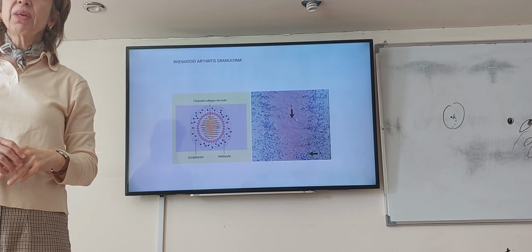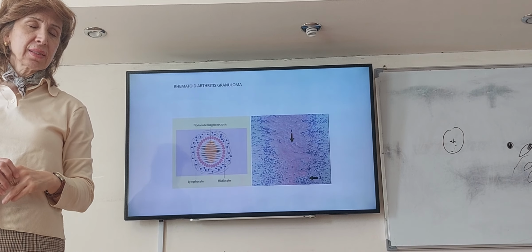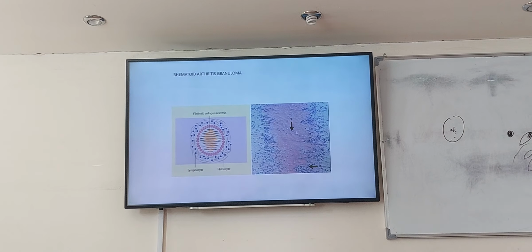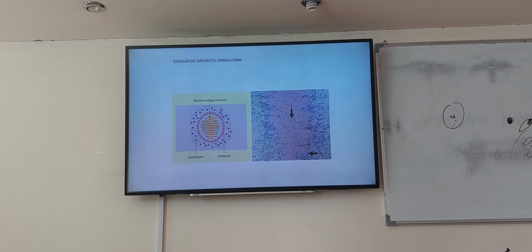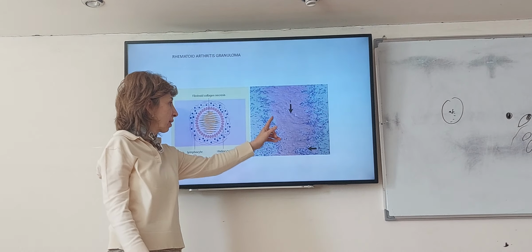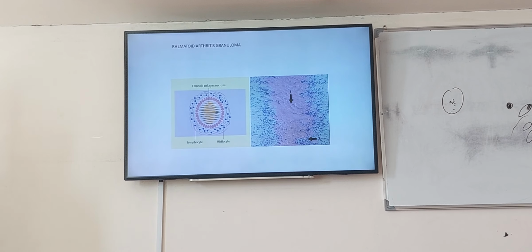Okay? But for me, remember, this is called histiocytic granuloma, palisading type. Remember the other one, epithelioid, pseudotubercular, separated. It is easy for you to study. So when you say palisading, something in the central will be fibrinoid, surrounded with histiocytes and lymphocytes. Okay?